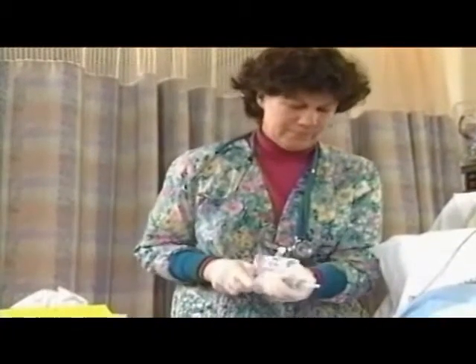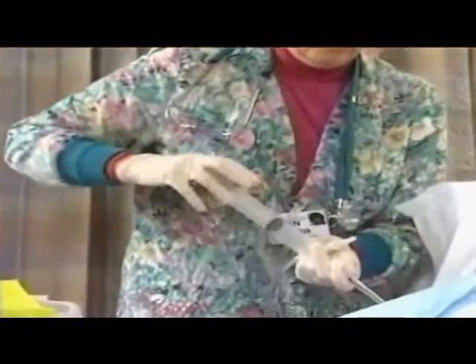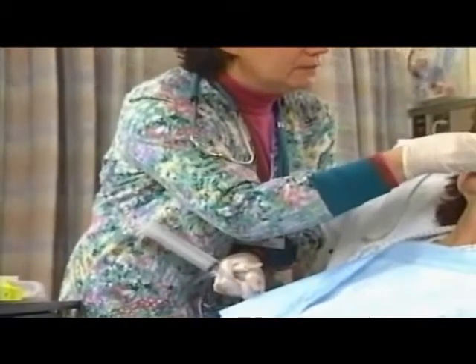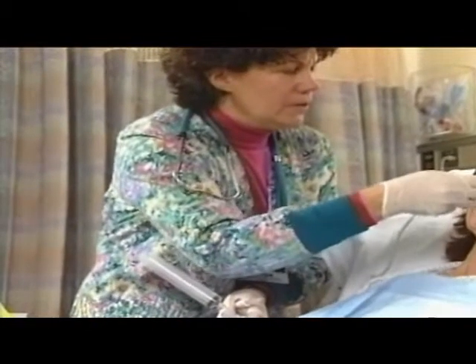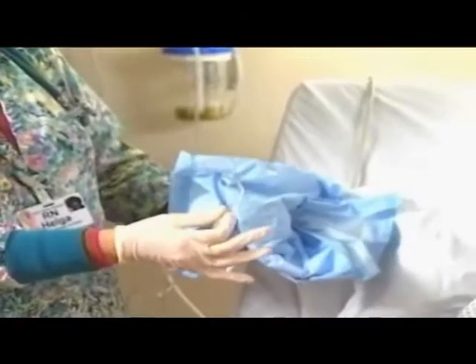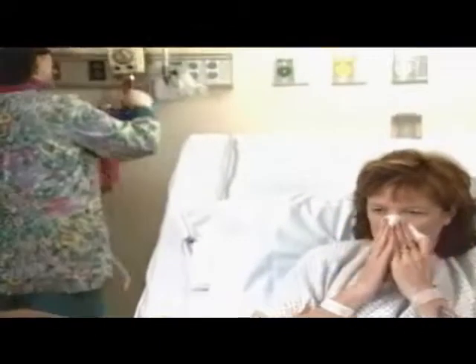Disconnect the tube from suction. Remove tape or attachment device from the nose. Ask the patient to take a deep breath and hold — this closes the glottis to prevent aspiration of any gastric contents. Kink or pinch the tube to prevent leakage into the respiratory tract as you remove it. Inspect the tube to verify intactness. Provide oral and nasal care and clean linen if necessary. Measure gastric contents and note color and consistency. Dispose of equipment according to agency policy.